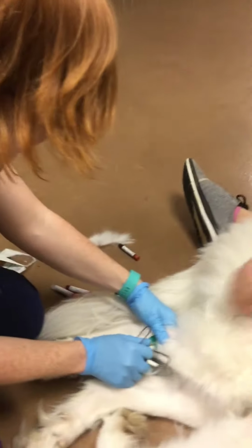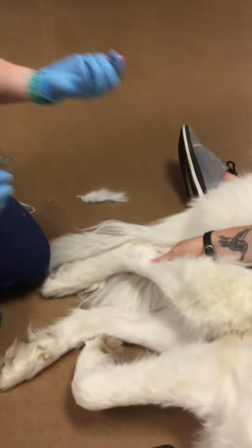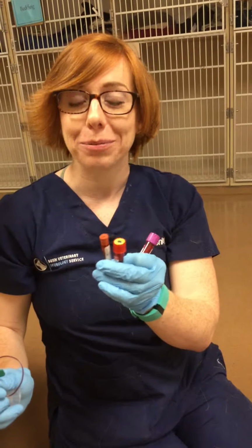And the serum here. So then we're gonna release the tourniquet and we're gonna hold off. And this one is already inverted. I'm gonna wait for these 2 to clot and then I'm going to spin them down.